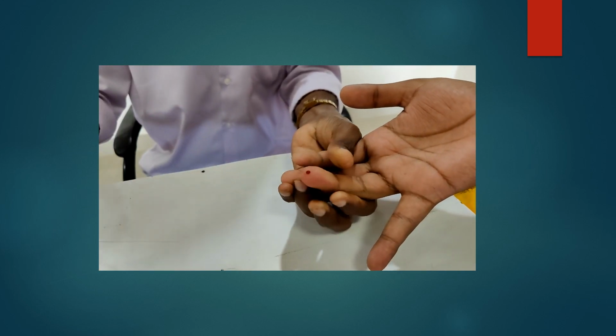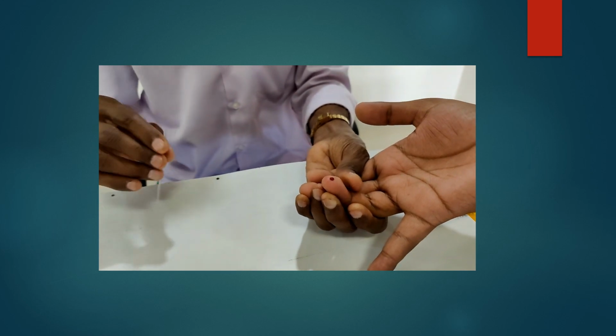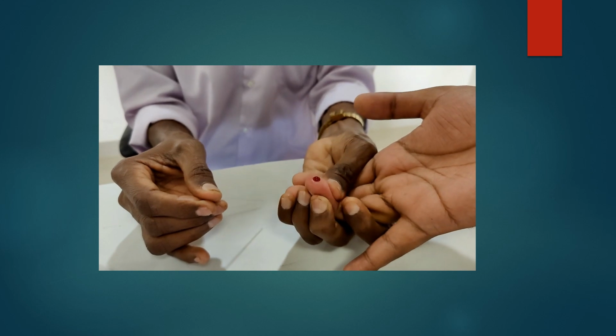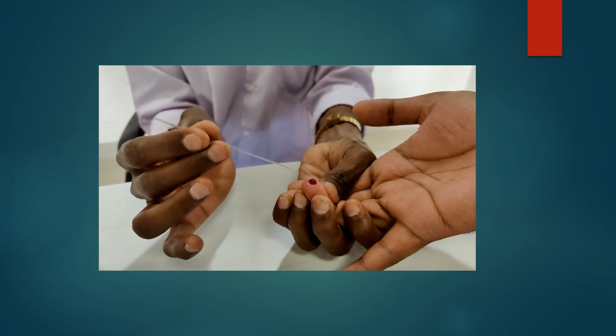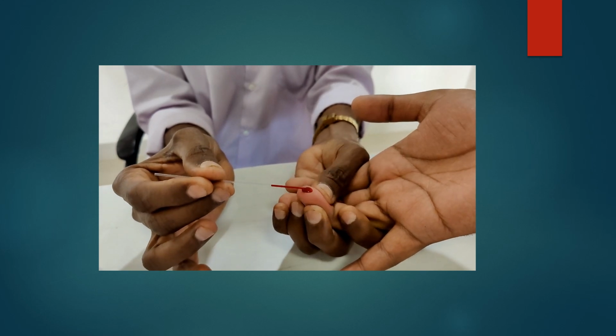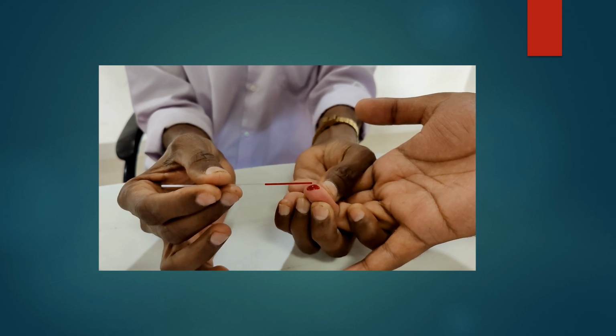First clean the finger with the spirit and then make a puncture. Start your stopwatch and note the time, okay? Make a large drop properly and then keep one end of the capillary tube near the drop and the other end slightly at the lower level. Blood will flow in automatically, okay?